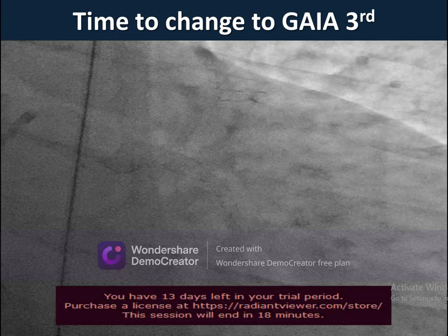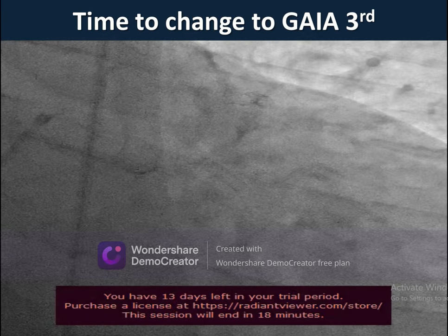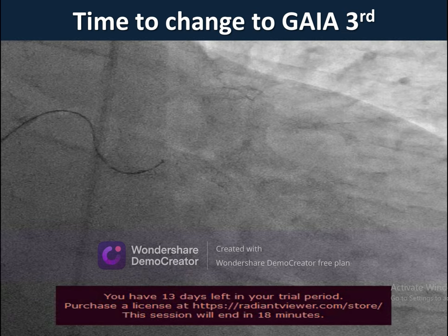Another projection. At that time, I started to realize that I need a stiffer wire. So I am escalating from Pilot 200 to a Gaia Third, because with my sense at that time, I felt that I need to do a well-controlled micro-dissecting passage inside this well-delineated stent frame.